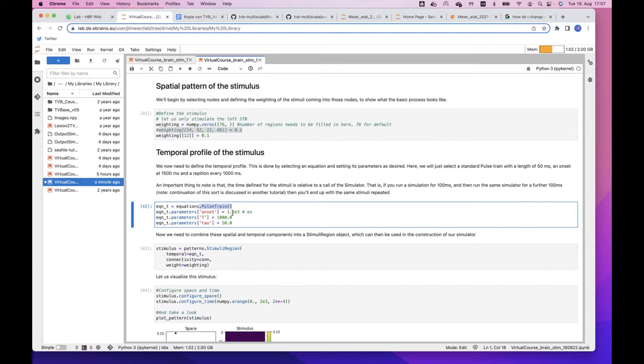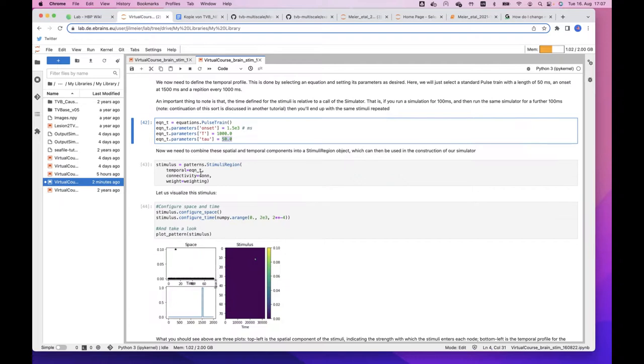It's just our first toy stimulus. There's no actual amplitude or something here. You will see that in a second. You can also, as you see here, make the stimulus go towards multiple regions, even with the same weighting or different weightings, however you want to weight your stimulus. Whichever region you want to target, you can just change the numbers of the regions here.